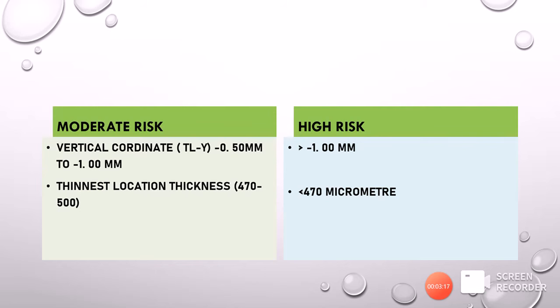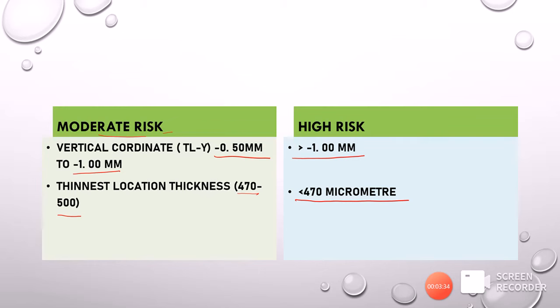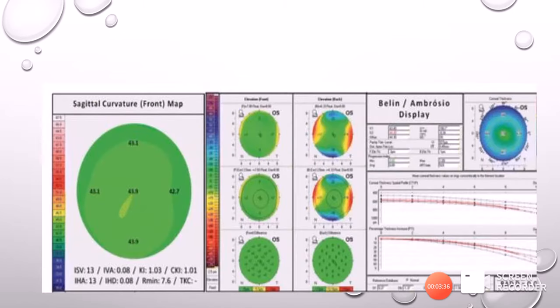In summary for pachymetry risks: a vertical inferior displacement of 0.5 to 1 mm is moderate risk, and more than 1 mm is high risk. Thinnest location thickness of 470 to 500 microns is moderate risk, while less than 470 microns is high risk. The BAD display shows the standard elevation maps, exclusion elevation maps, and the difference between them — in this example case it appears normal.